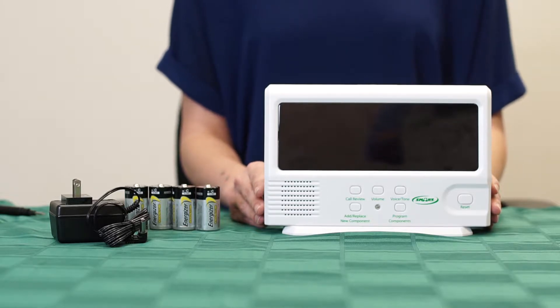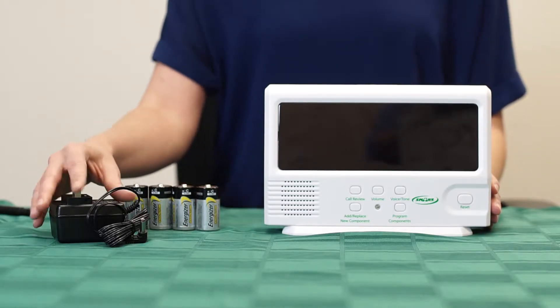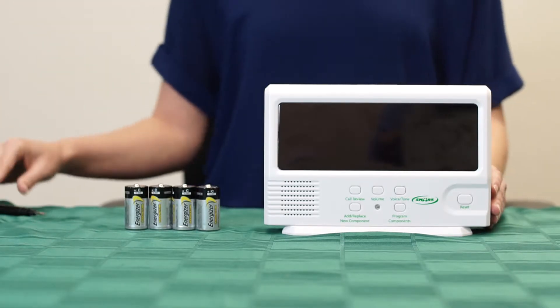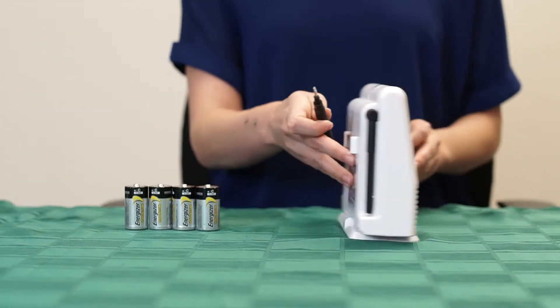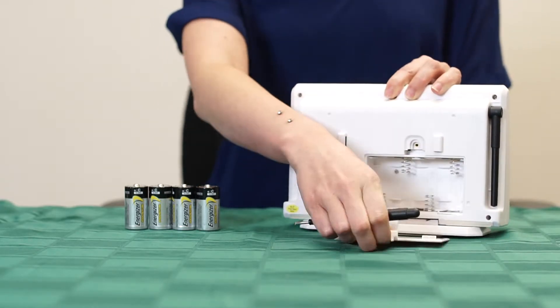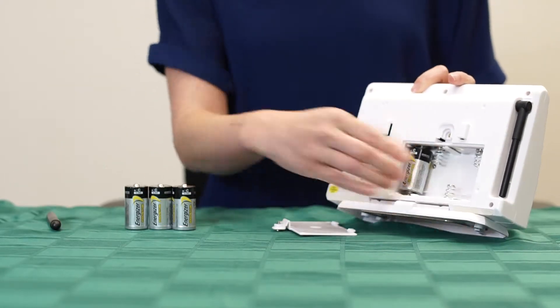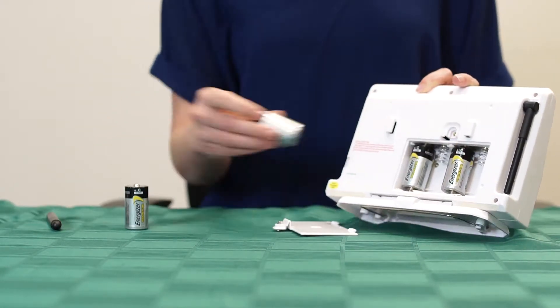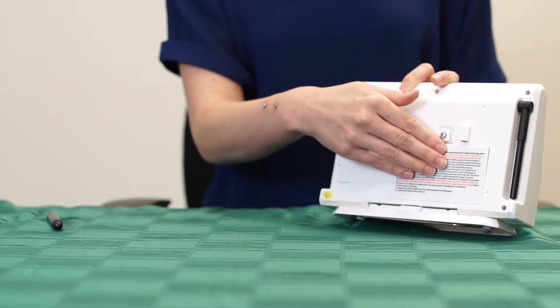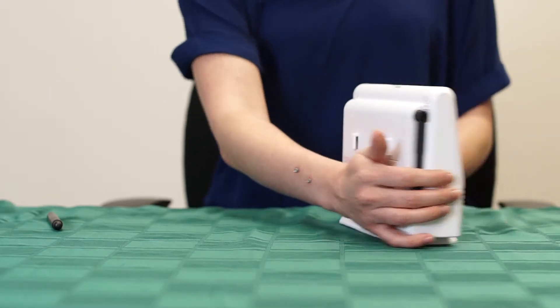To begin, we will need either four C-sized batteries or an AC adapter to provide power to the monitor. For this video, we will be using batteries. Remove the cover to the battery compartment and insert the batteries into the back of the monitor. After the batteries have been inserted, replace the battery cover over the compartment.